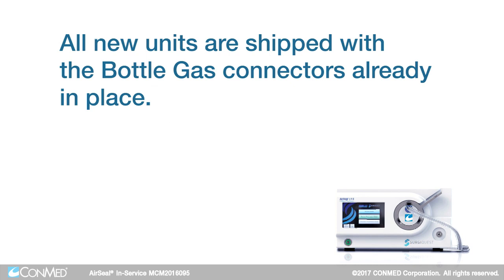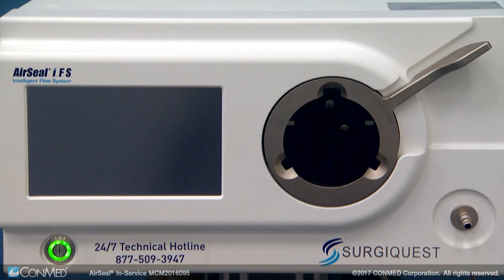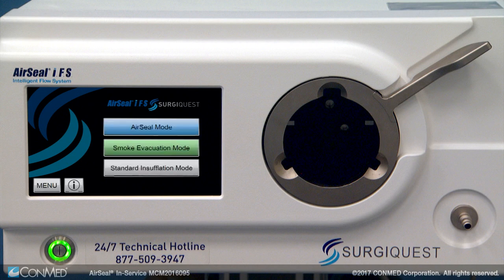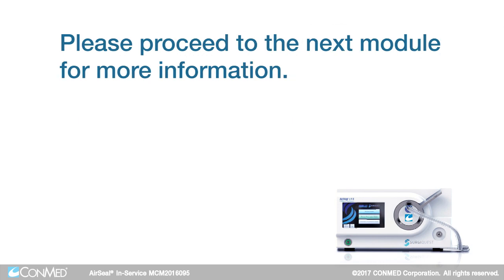Please note, all new units are shipped with bottle gas connectors already in place. To turn on the IFS unit, once the CO2 has been turned on, press the ON switch on the lower left side of the unit — it will illuminate green. This will initiate the self-calibration process, which takes approximately 2 minutes. Do not insert any filtered tube set during this self-calibration process. Proceed only after the 3-mode home touch screen is displayed. Please proceed to the next module for more information.